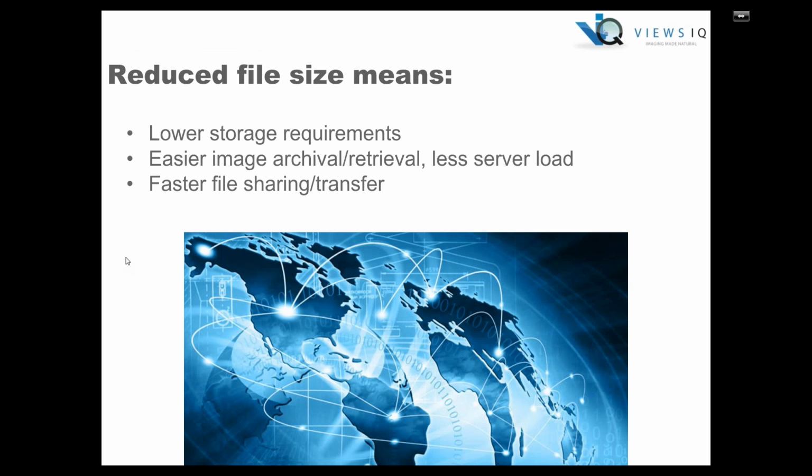This smaller file size means that your storage requirements are going to be a lot lower. It'll be easier to archive and retrieve images with less load on your server. And because the images are smaller, file sharing and transfer is going to be inherently faster.